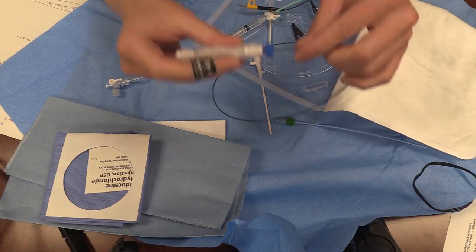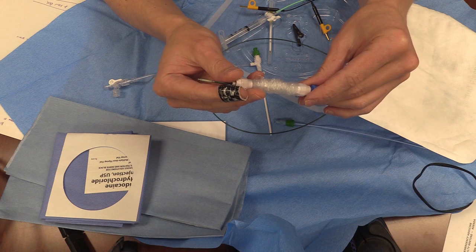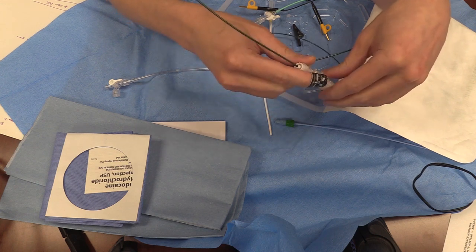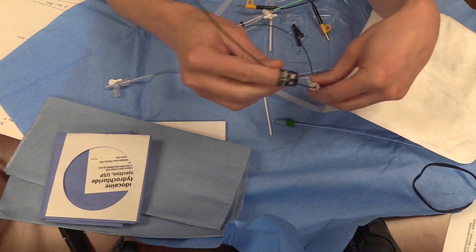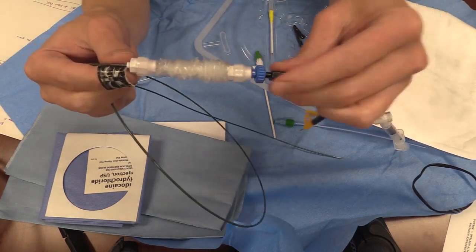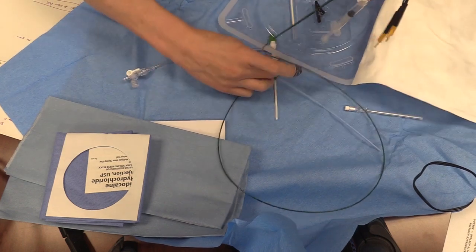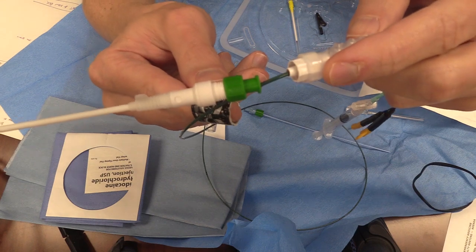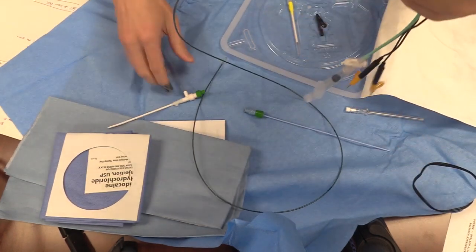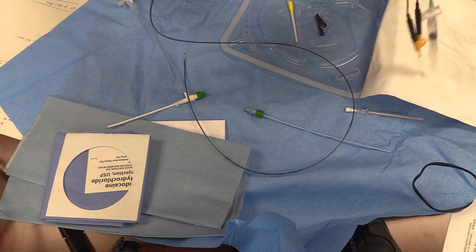We have the lead extenders on and have tested the balloon. Next we're going to put on the sheath. Forgetting this is really embarrassing — it becomes a nidus for infection, and they can't reposition the pacemaker either. In this new kit it's hard to forget because it's right there, but in the old kits it was a separate item, so it was very easy to forget. Bring it all the way back to the back of the pacemaker setup. The side with a luer sticking out attaches to the cordis — that's how you know which side goes on — and the blue side is just a lock.